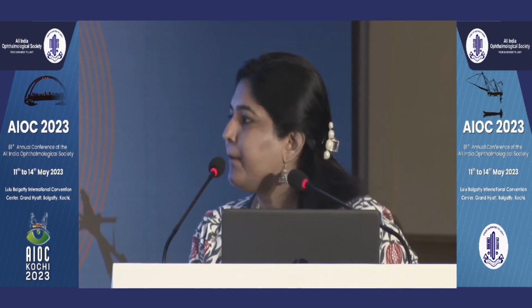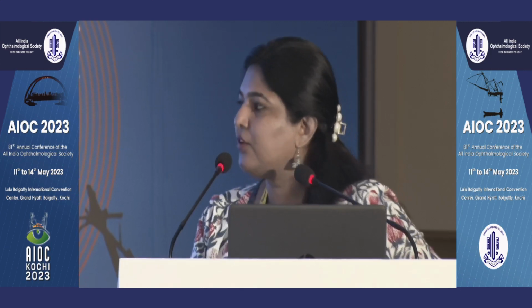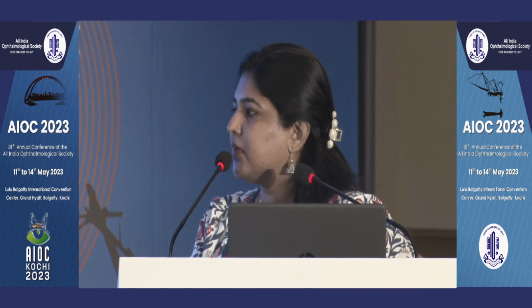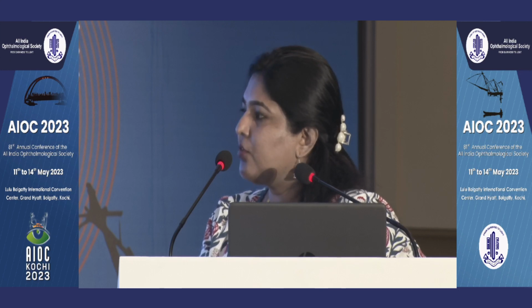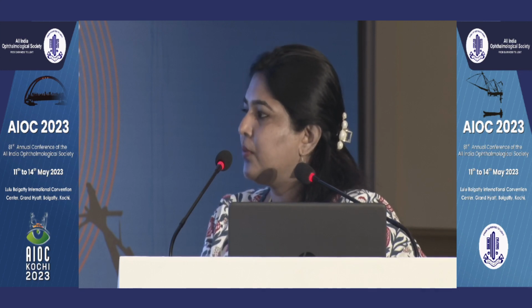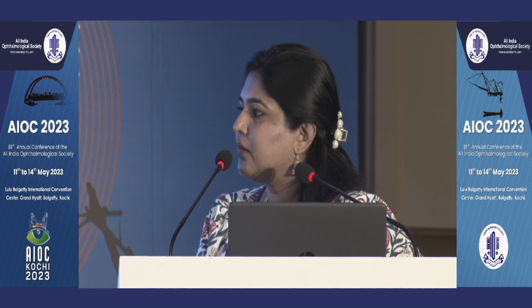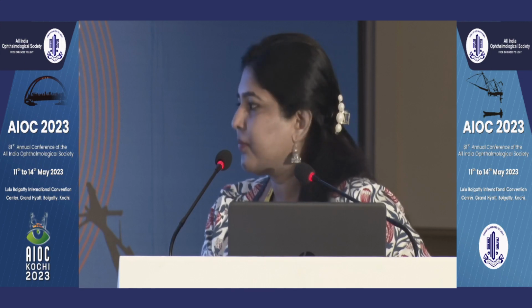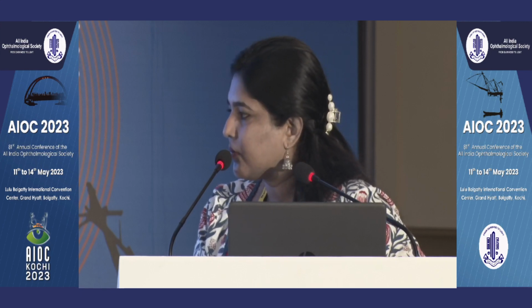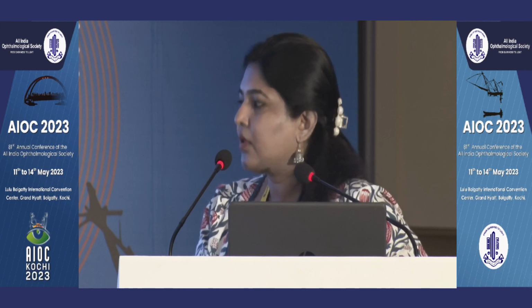Usually in these advanced glaucomas, you can't use a linear correlation; it tends to change. It's a negative correlation we usually get when the macular layer thickness is reduced, and in HFA we get a negative correlation. So there are other statistical tests that can be used for these when you're not expecting a linear correlation exactly. What he means to say is that in advanced glaucoma, because of the fluctuation, we cannot use the linear model for the analysis. There are various other methods you can use for that. Okay, nice.